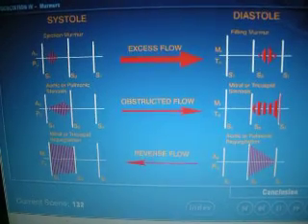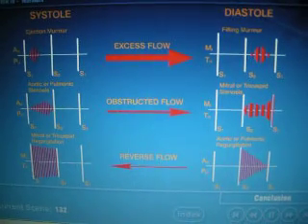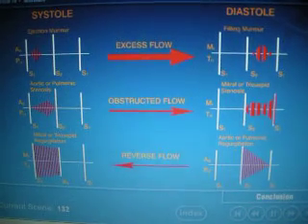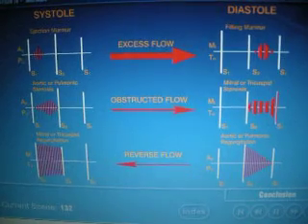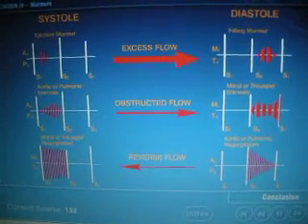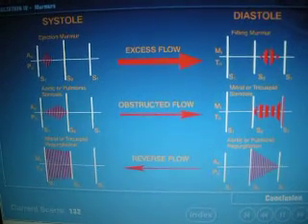We have now covered the most common murmurs in pure form and have been shown how they can vary with severity over time, and how the same murmur may be innocent in one person, yet signal the onset of serious disease in another. Knowing the prototypical signatures of these basic murmurs as shown here provides a solid basis for their identification. A hard copy of this material is provided in your workbook.